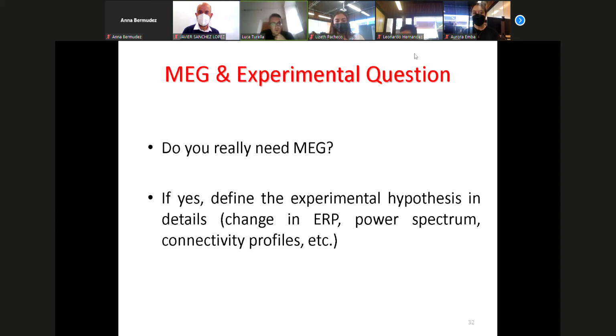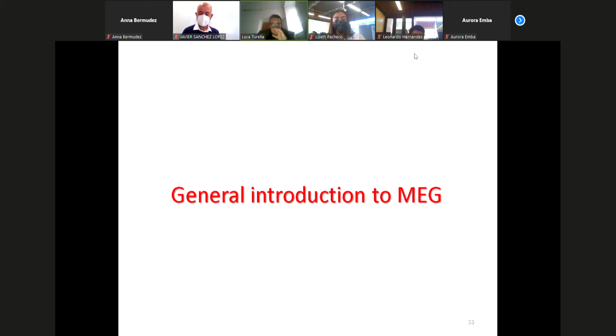If you think MEG is a good tool for you and it might be very good for answering what you want to investigate about the brain, then, given all the types of analysis that I've shown you up to now, the first thing that I always suggest to my students is: take time, think about what is the question you want to answer and what type of signal you might use from MEG to answer your specific question. Because the signal is so rich and so complex that you might go on analyzing the data for years if you don't really specify what is the signal in the brain that you want to see changing based on your experimental question.